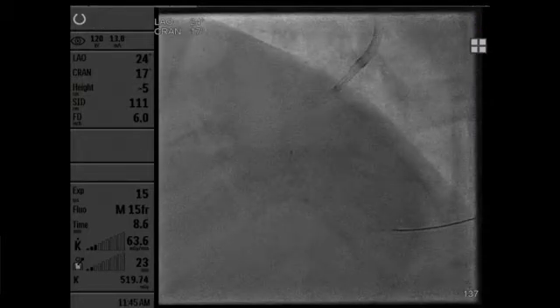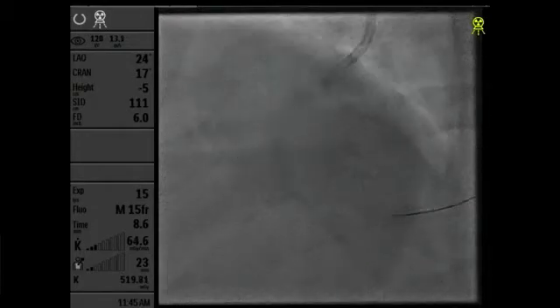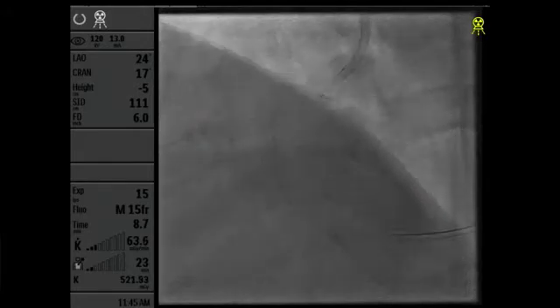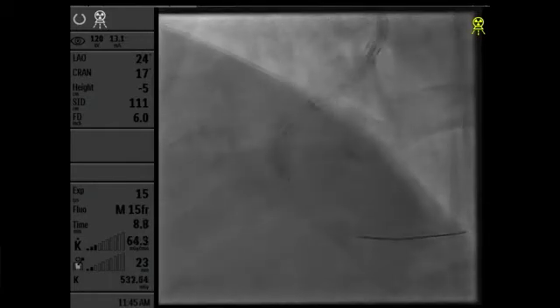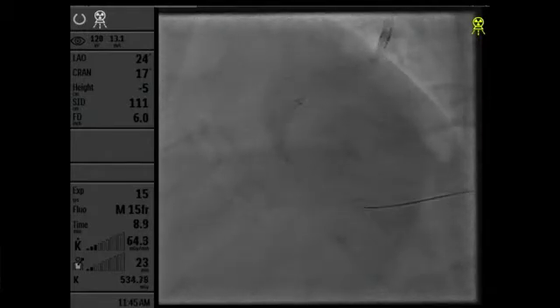Otherwise, just bring the telescope all the way down distal. Yes, I will. Go up here, please. Ready? Nominal. Okay, going up to, what would you like? 10, please. Do you have your audio? Yeah, we're good. We just cut the audio back, Ron.